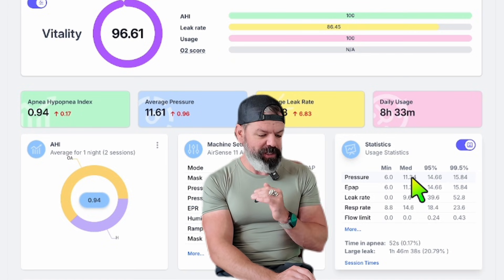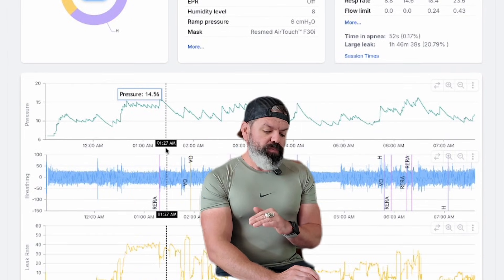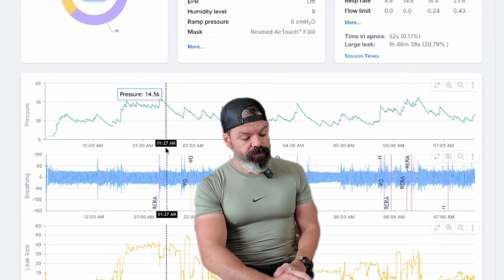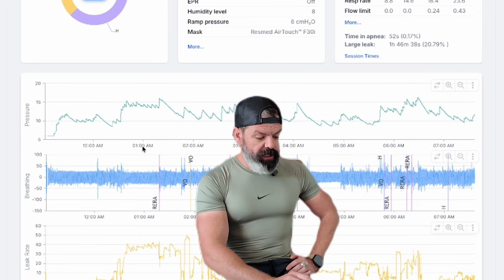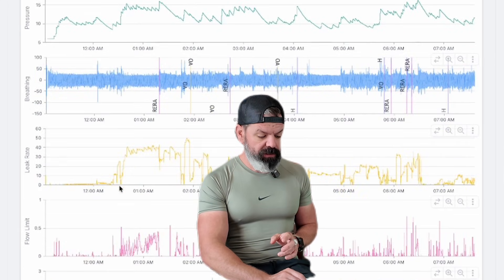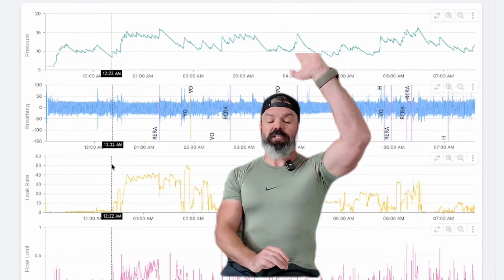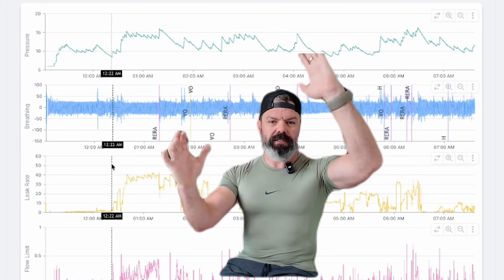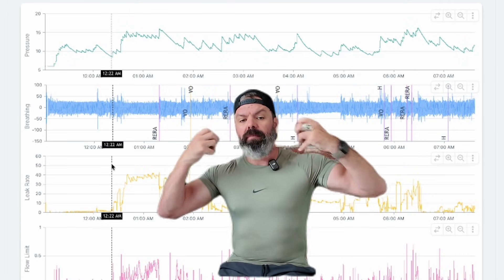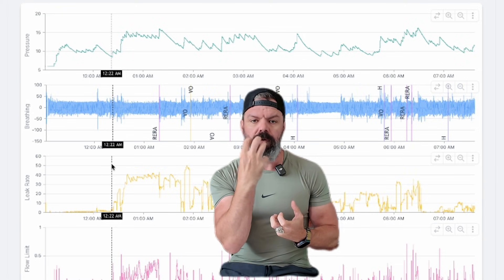With ResMed devices you can go lower than the average pressure. On one fixed pressure the whole night he's probably going to get better results, better comfort, better leak, better everything. Pay attention — the pressure jumps up in response to a bit of flow limitation, pressure jumps up, and then leak shoots up with the pressure. That makes sense: more airflow, more leak. But because of that, because there's more air coming out of the mask, there's less pressure inside the mask, so there's less therapy. It's all about the pressure inside the mask.